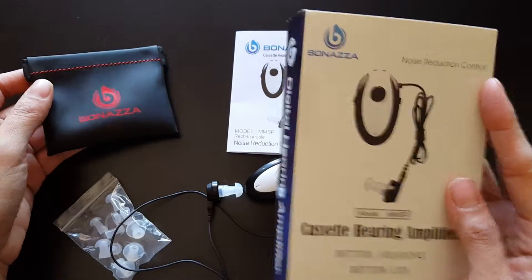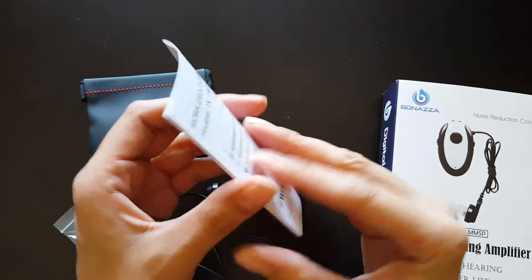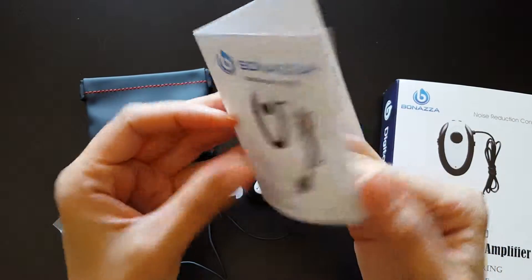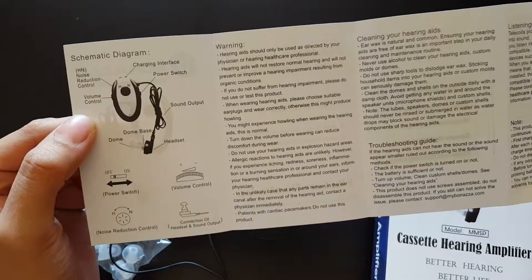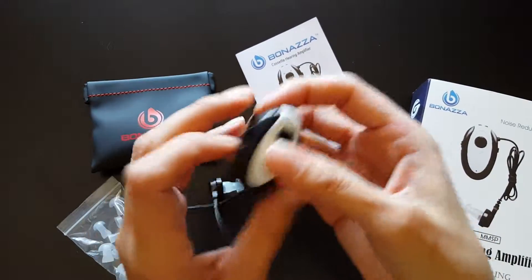So this is the box that you get, and it comes with a little pamphlet that gives you a basic overview of it. It also comes with a plug — I left that in the wall — but it comes with a plug to recharge the device.